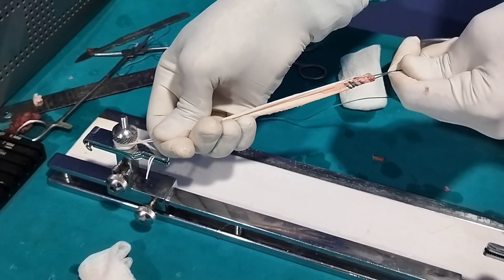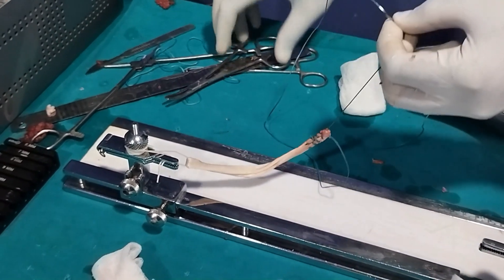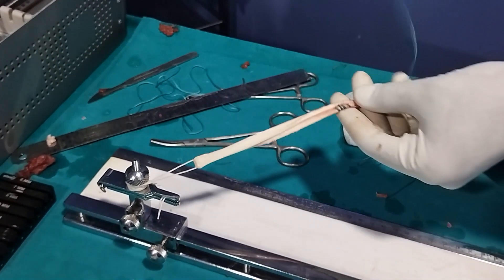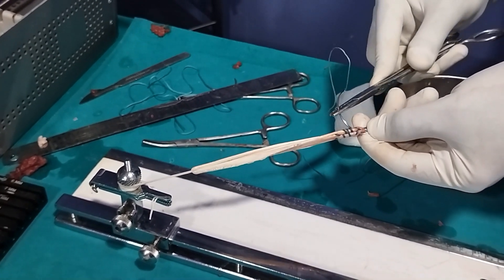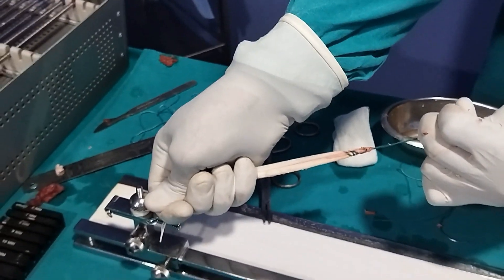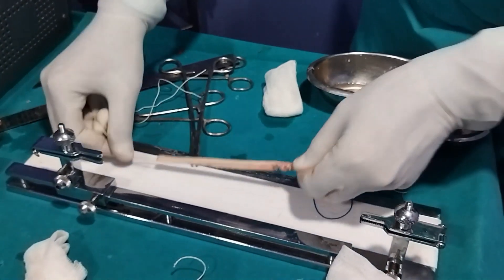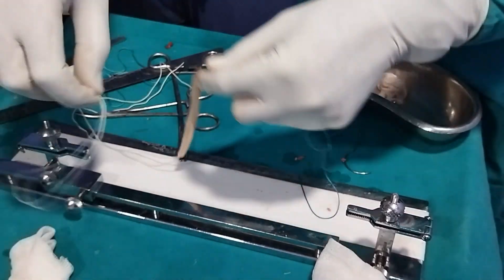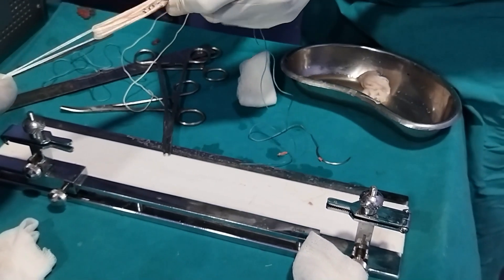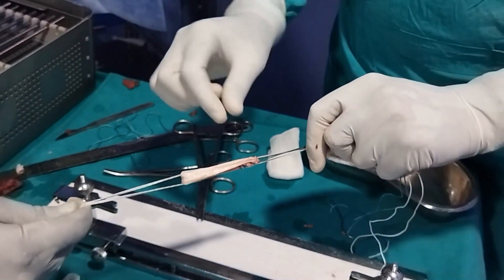Now the entire tissue has been made into a loop — we have created a loop from this tendon, making it double-stranded. We then take another thread loop and make it into a quadrupled graft. This is now a quadrupled graft with four strands.